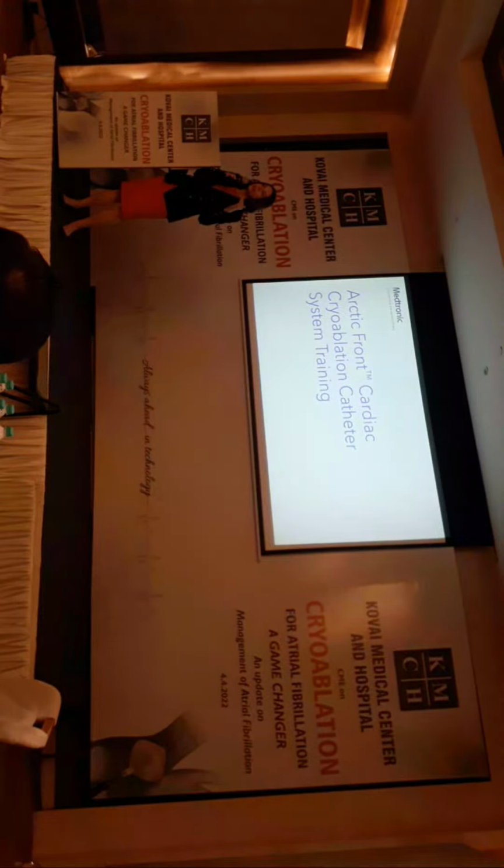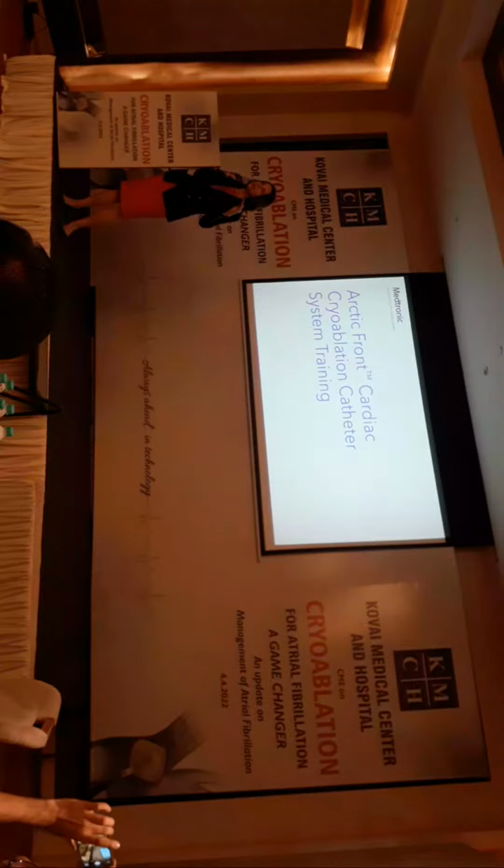The current criteria for doing an ablation for any patient, and by the way, there are still people in the US that do radiofrequency ablation over the cryoballoon. Again, like with everything, there are different levels of adopting a procedure, but we always recommend doing it on symptomatic patients. And so, there was a question earlier, when do you decide to do another ablation or decide even to do a single ablation?